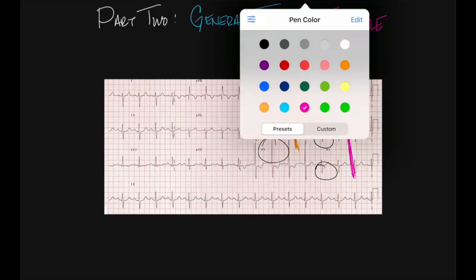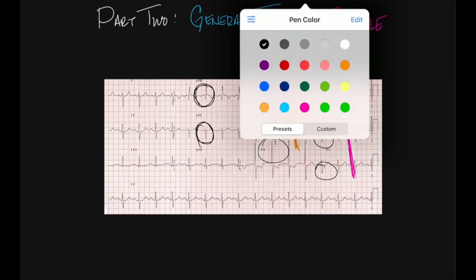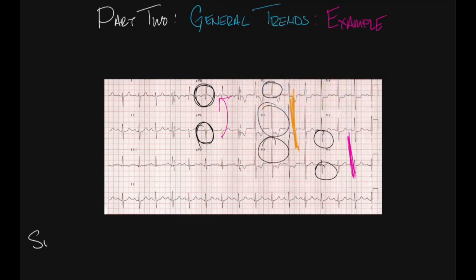And then if we look at these limb leads, we notice something interesting. We see that AVR, which looks at the right, has a dominant R wave. AVL, which looks at the left, has a dominant S wave. So again, that implies that electricity has been shifted towards the right. So all of this suggests to us that we have an increase in the right ventricular activity.